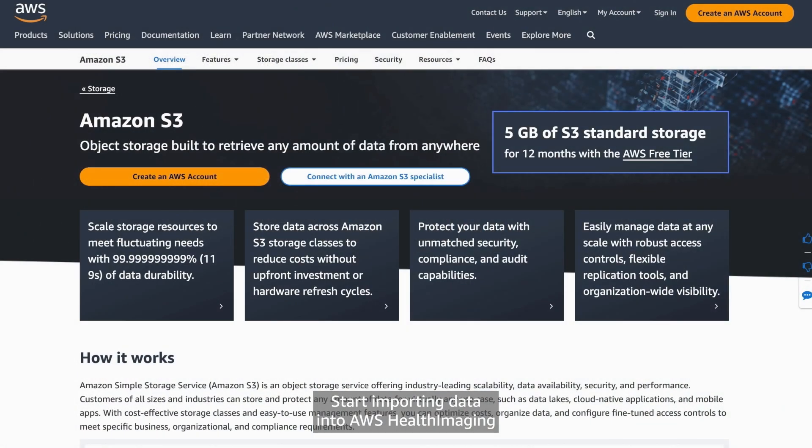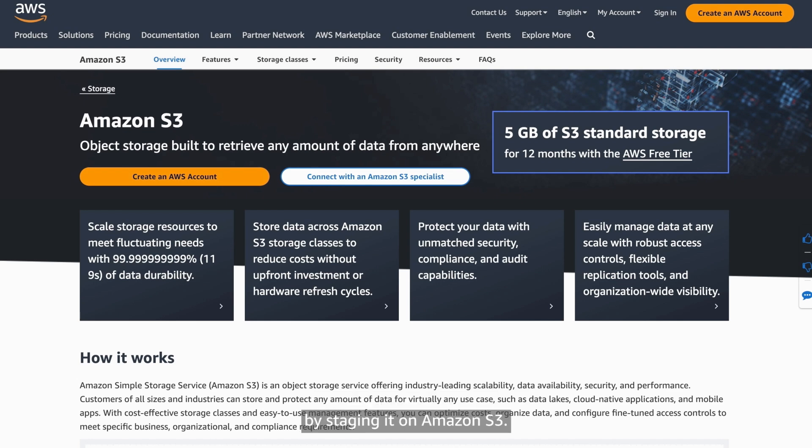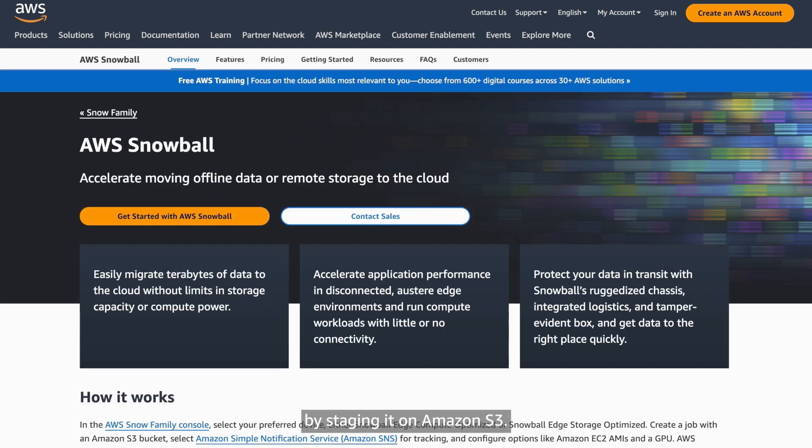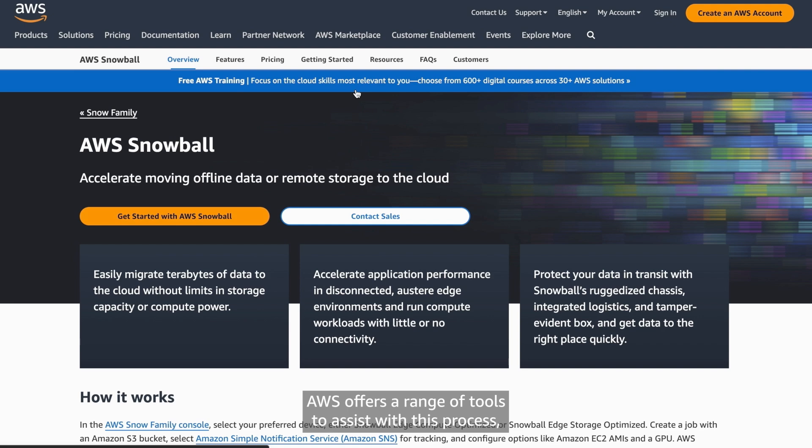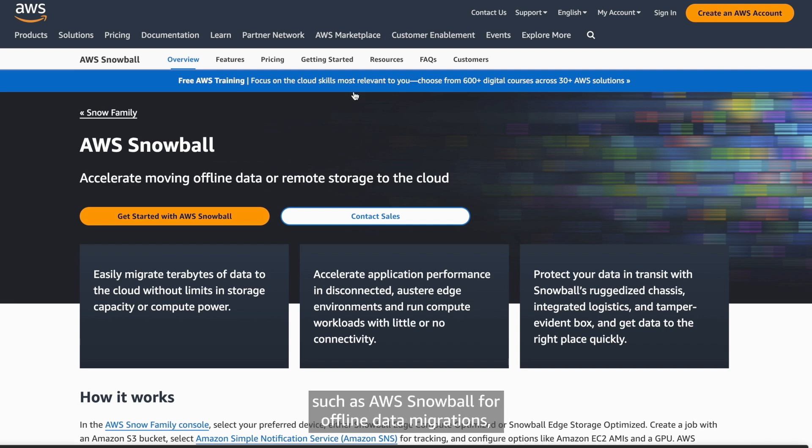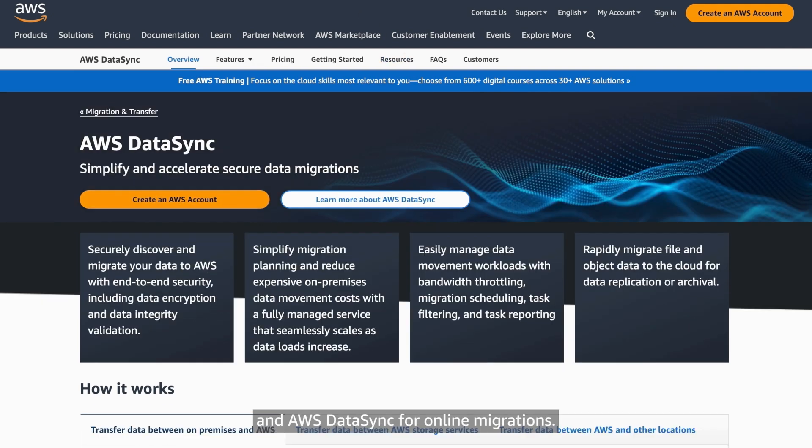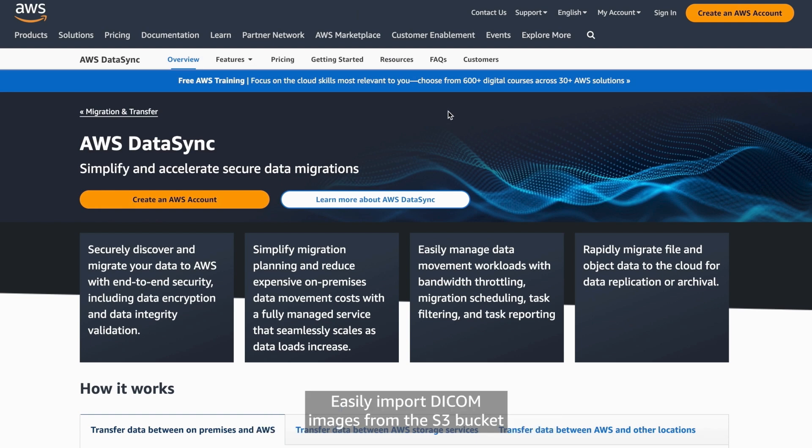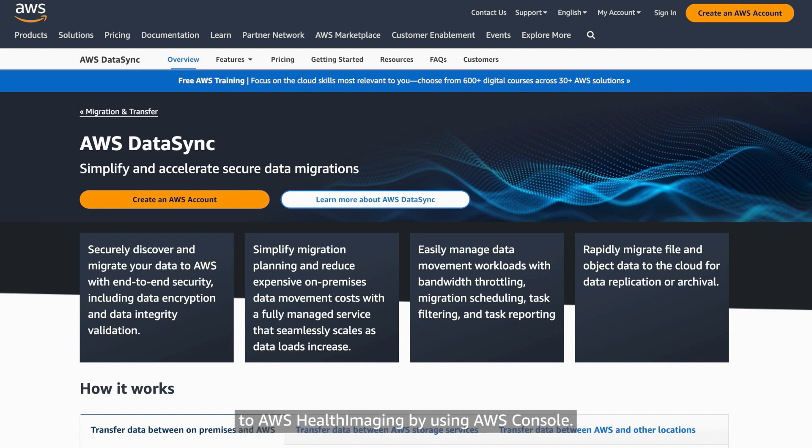Start importing data into AWS Health Imaging by staging it on Amazon S3. AWS offers a range of tools to assist with this process, such as AWS Snowball for offline data migrations and AWS DataSync for online migrations. Easily import DICOM images from the S3 bucket to AWS Health Imaging by using AWS Console.